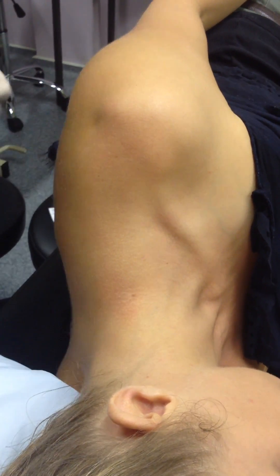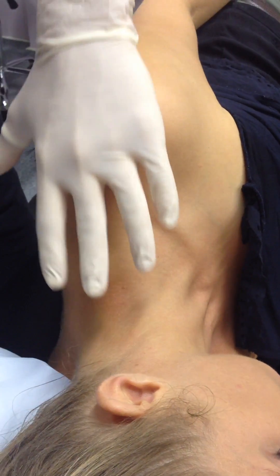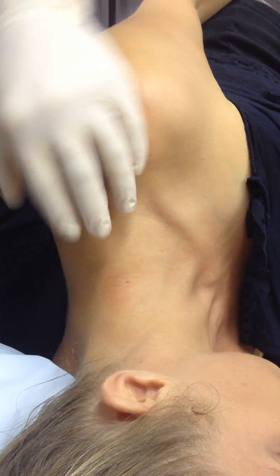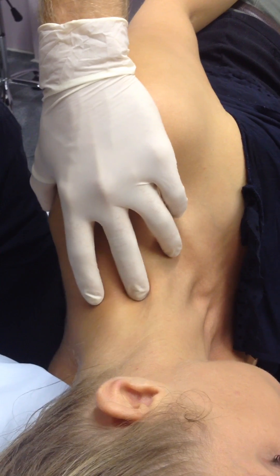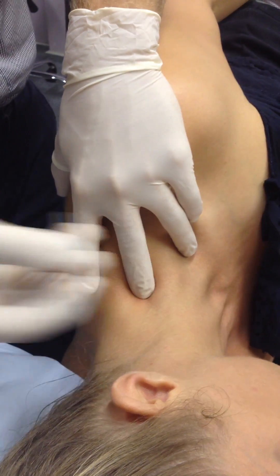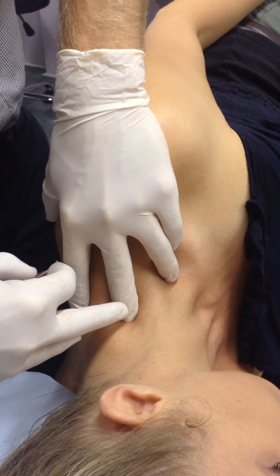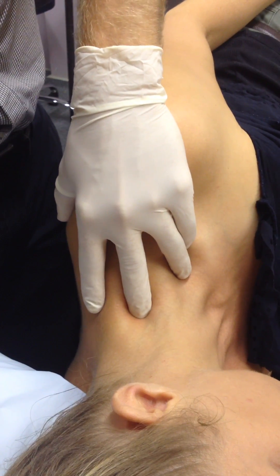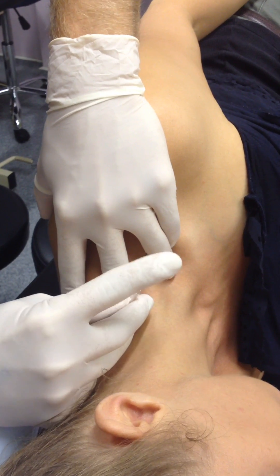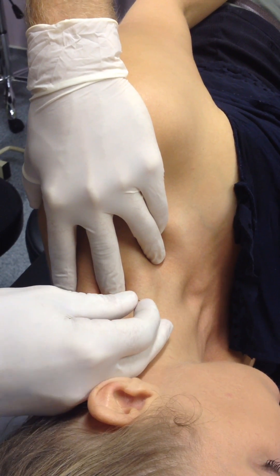So needling with this is — I tend to always do it — I've got my hand over here and then it just leaves this one nice and free. I'll swap hands. So I've pushed, got left scap posteriorly or behind my finger and then I drag it back away from those transverse processes. I can push down with my finger here and I'm pushing straight onto the transverse process, so I know that muscle is posterior to the transverse process. And what I do is needle in and direct it medially but tip it posteriorly as well.